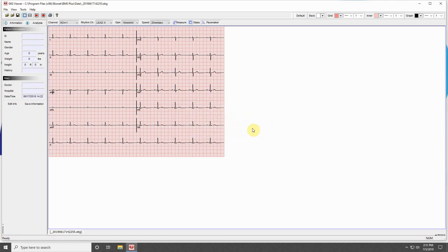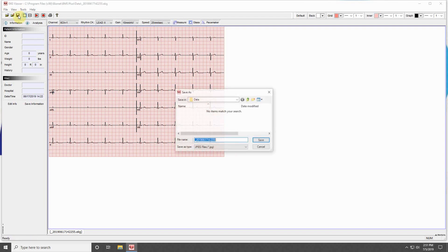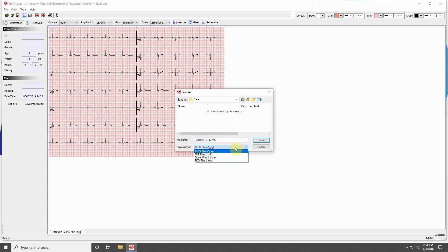Starting from the left in the toolbar below, these buttons allow you to open, close, or save an ECG. Note that when saving, you may use the bottom drop-down menu to determine if you would like to save files as a JPEG, PDF, DICOM, or EKG file.